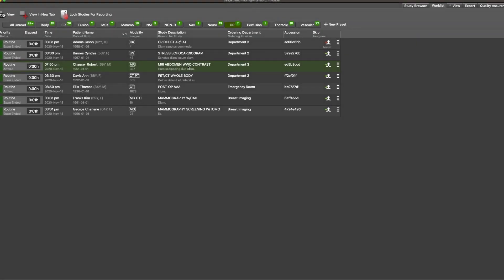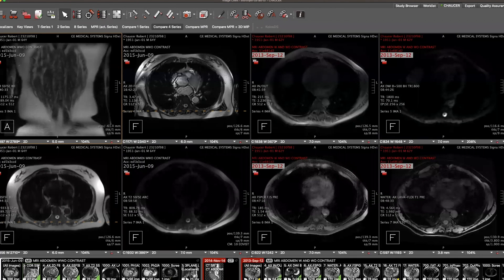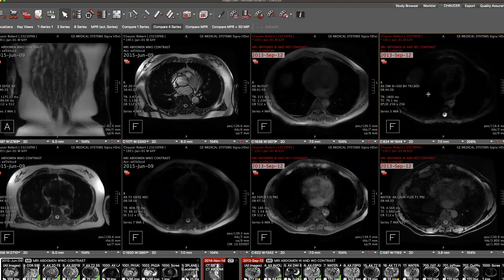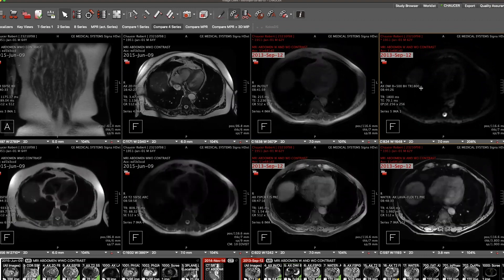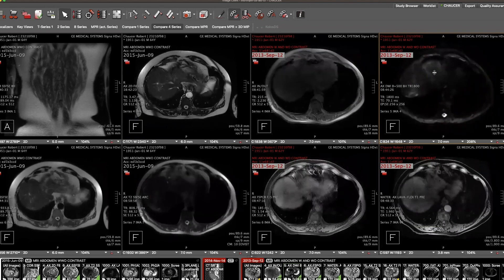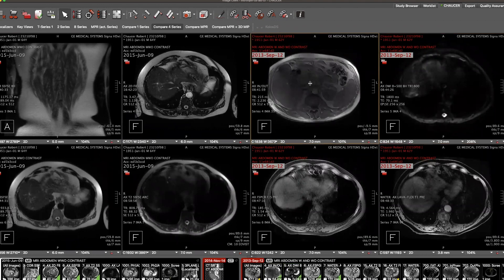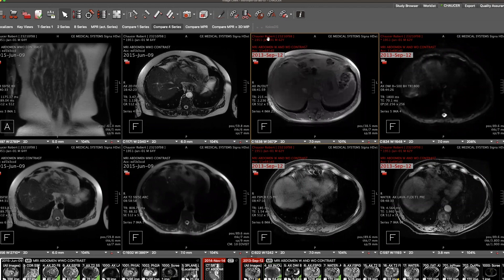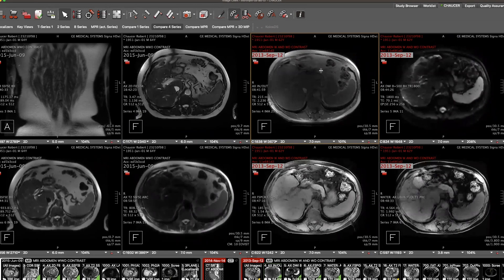From the work list, we're going to open this MRI with contrast. We default to a compare four-series layout, which shows the first four series of the current study on the left display and the first four series in red text on the right display, which is the prior study. I'm going to initiate a linking of both the current and the prior by selecting a hotkey that I have configured for myself. Now I can continue to scroll through the images. If I want to interact with any one series without them being linked, I can simply toggle off the linking, interact with the one series, and then turn the linking back on to update that linking at that particular position.